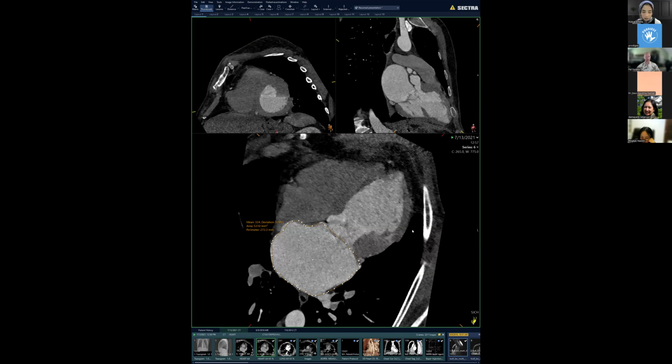Another thing to keep in mind, if you don't have a cardiac gated study and you don't have an end systolic phase, which is the proper time to measure this, you can only underestimate this. So if you have a random phase of the cardiac cycle and the left atrium by this measurement appears enlarged, it's definitely enlarged, because at end systole it would be bigger, because that's the time point when it's at its largest. So any other phases of the cardiac cycle, you're likely to underestimate it. So if your measurement already hits above 25 centimeters squared, it's very, very likely that it is enlarged.